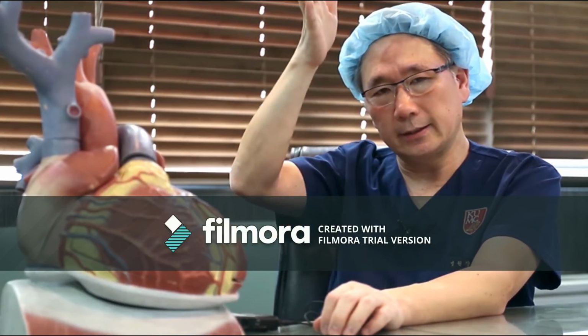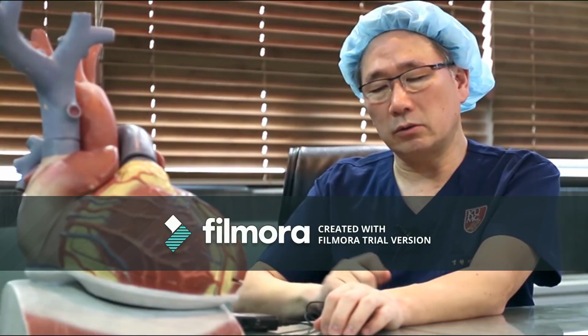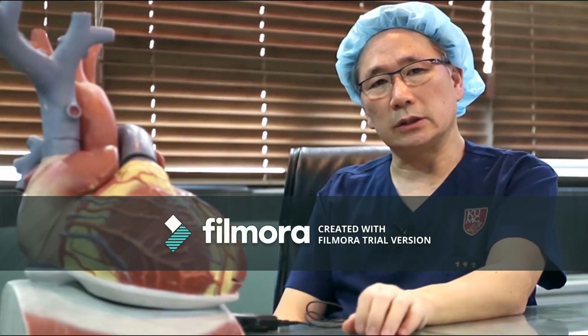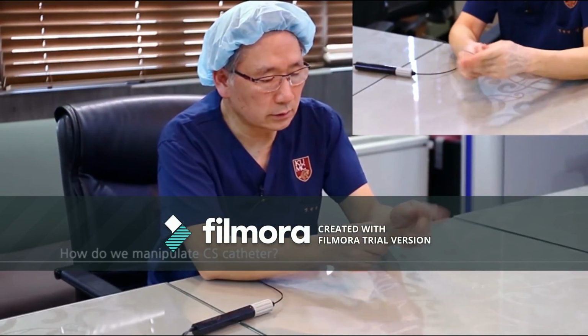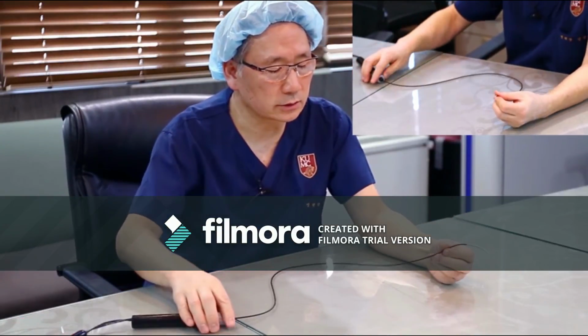Usually, I prefer to go a little bit more posterior and lower compared to the first one. Okay, in case of failure of the puncture, the second puncture, we use one guide wire left and then follow the ablation sheath, and then another sheath follows the one guide wire technique. Yeah, either way.